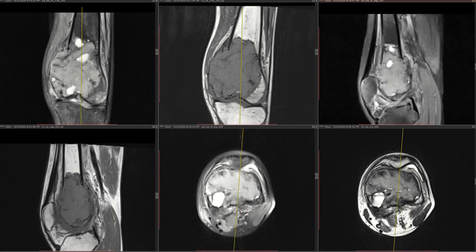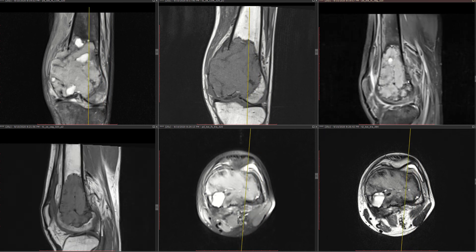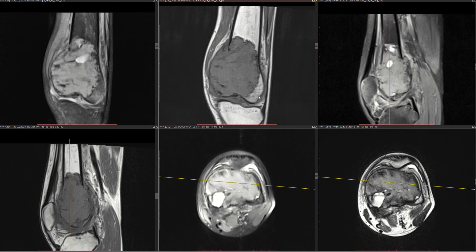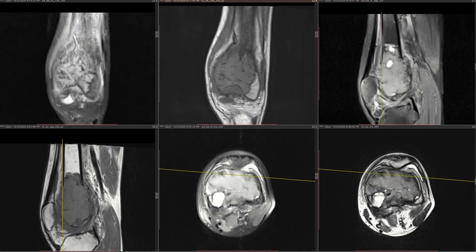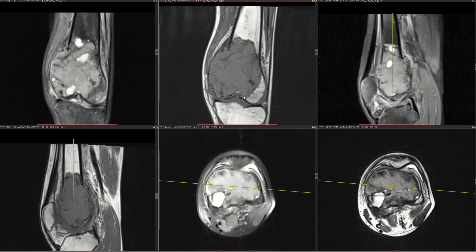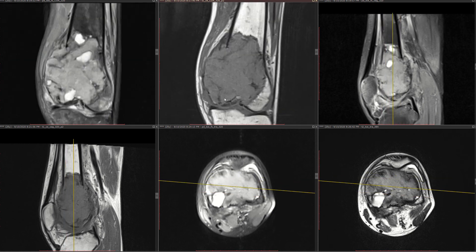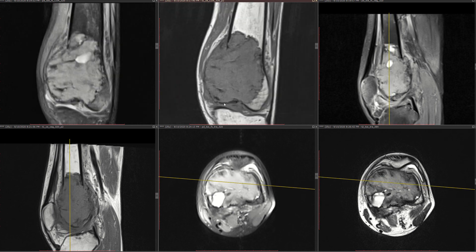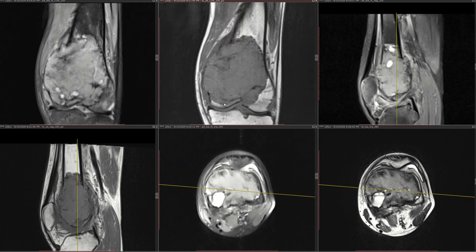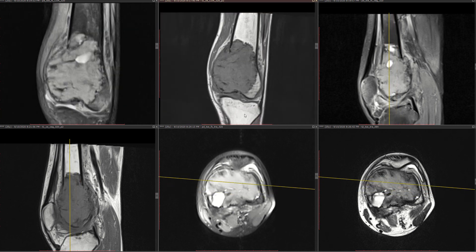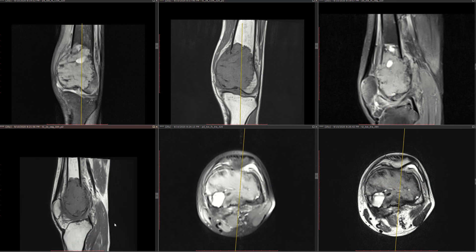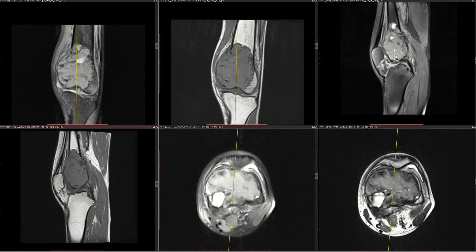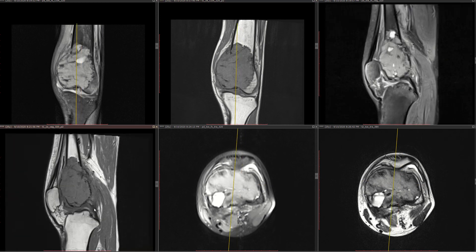Whether the joint is involved or not becomes important, as it determines what type of resection they will perform. Unfortunately, I feel the joint is involved here, because if you look closely, the distal part of the cortex is gone. So unfortunately the joint is involved, and I'm not sure exactly what kind of resection they'll do, but that's the situation.